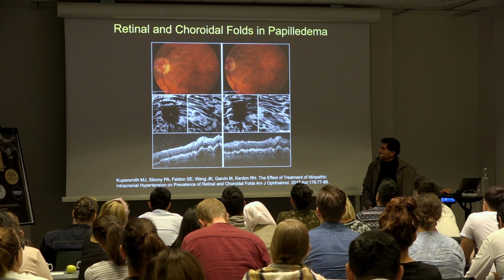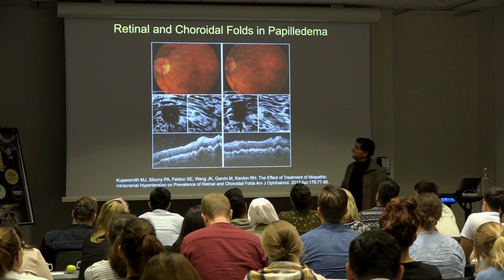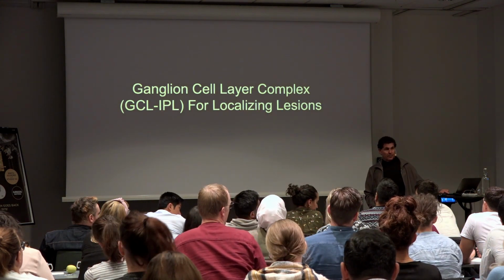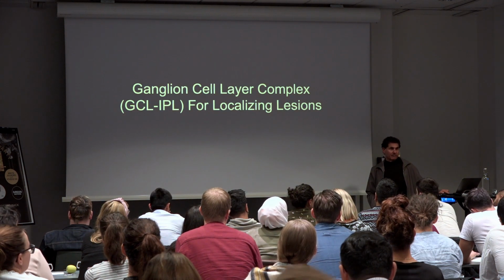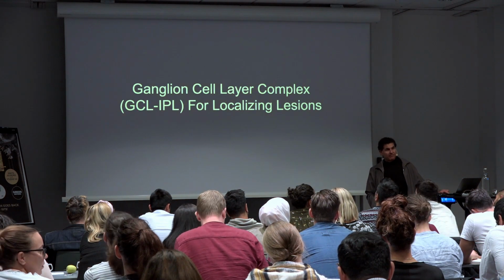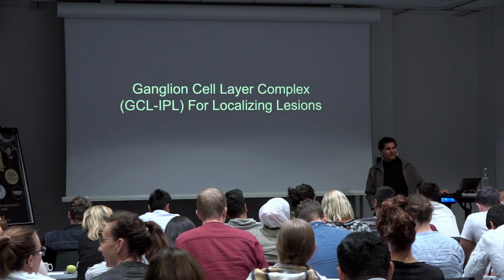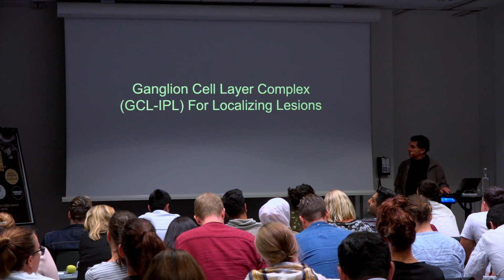And here's choroidal folds, which is not wrinkles in the retina, but at the deeper layer. Those are not as common. Sorry, but was it just papilledema or was it optic disc edema also? So when you have the radial folds, it's papilledema. If you have just the peripapillary wrinkles, it could be either. But for sure, don't make a diagnosis at this point of pseudopapilledema if you see wrinkles. We haven't seen pseudopapilledema yet that have wrinkles.